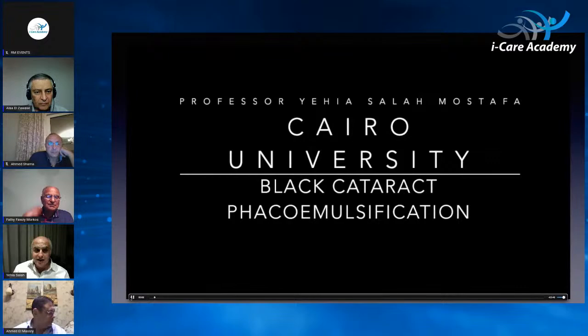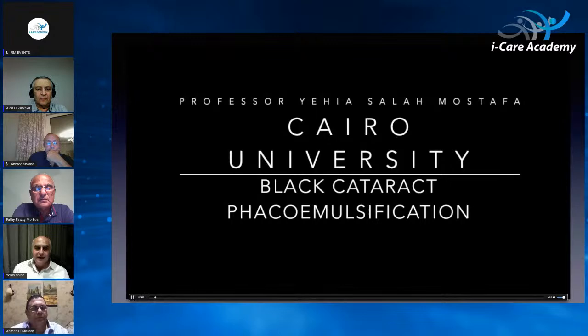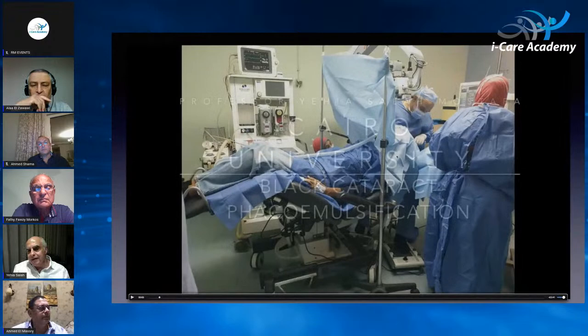Let's move to another case. This is a very particular case because I have multiple difficulties. The patient was more than 85 years old. He has kyphosis. We had to position the bed, as you can see, and this is the maximum that the patient can tolerate in this position. So he had a black cataract, as you're going to see, but I had to work standing.